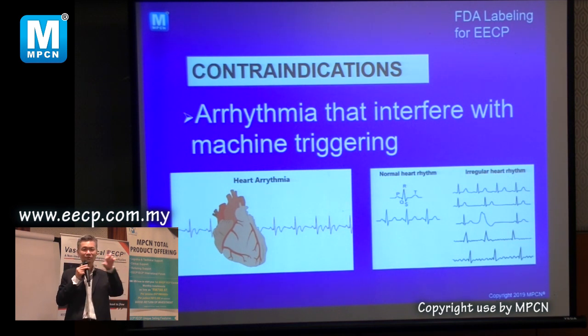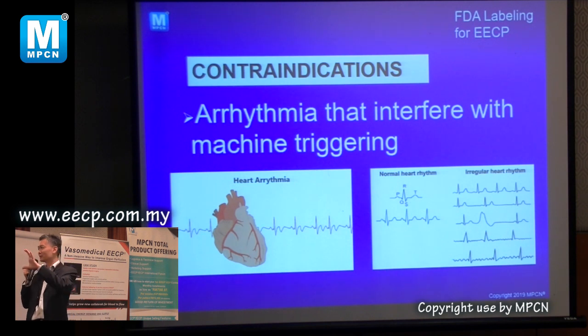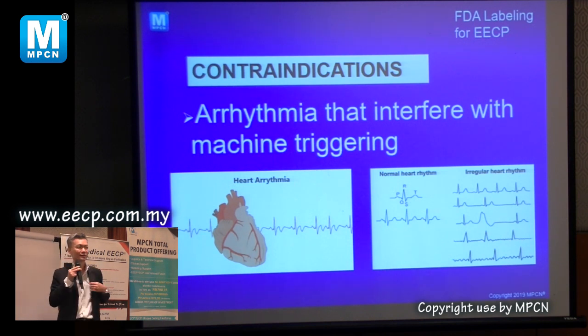One is the placement of the ECG, make sure it's big enough. So everything has to be done properly. The skin preparation must be done properly. Skin is good so that the ECG is good. If it's not good, then there is a lot of interference.